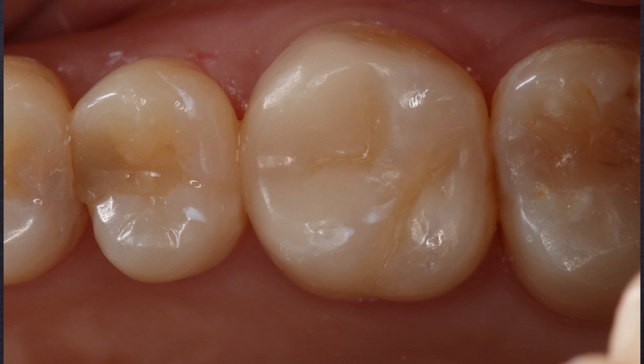That's a very nice outcome for that patient. That restoration is going to serve that patient for a long time, and hopefully he or she will be able to come in and get those other composites replaced there — it looks like they're in a little bit rough shape on those two adjacent teeth.